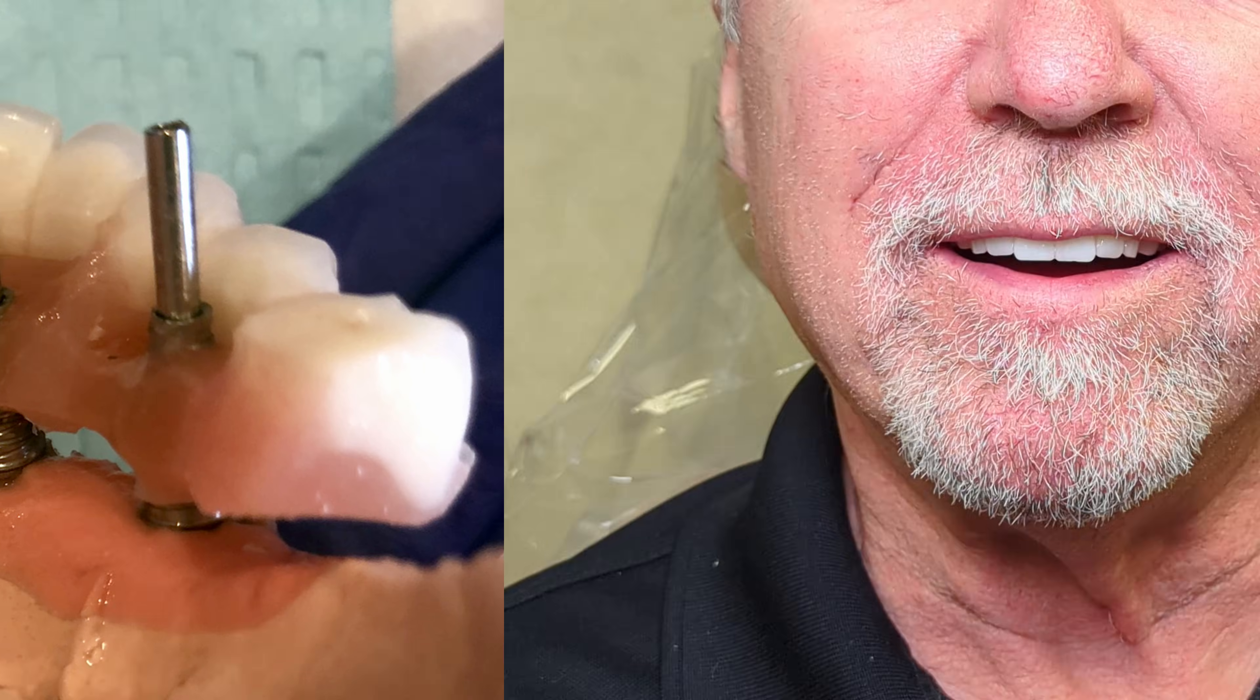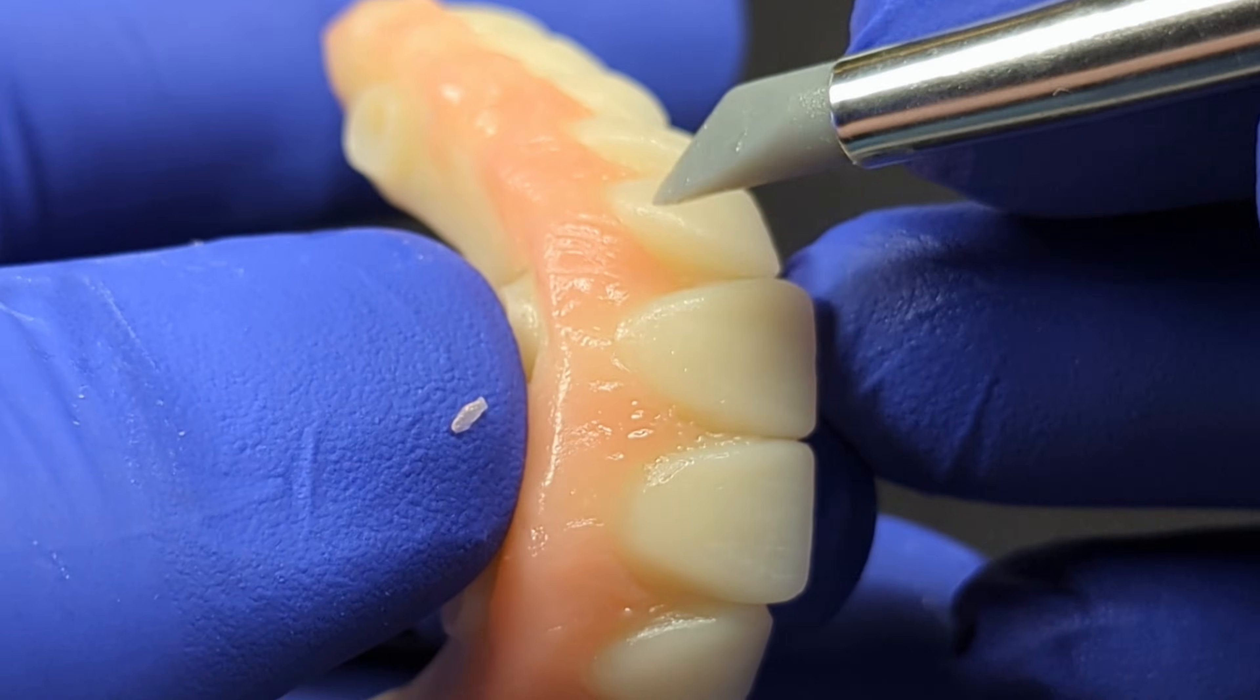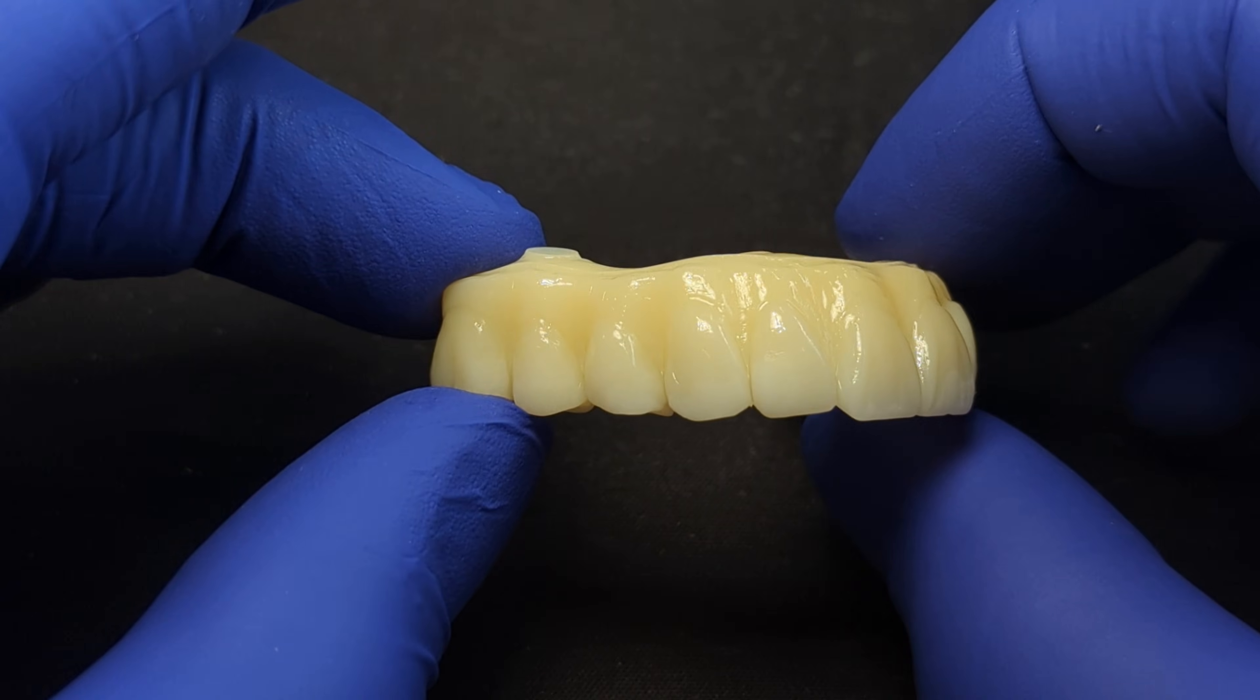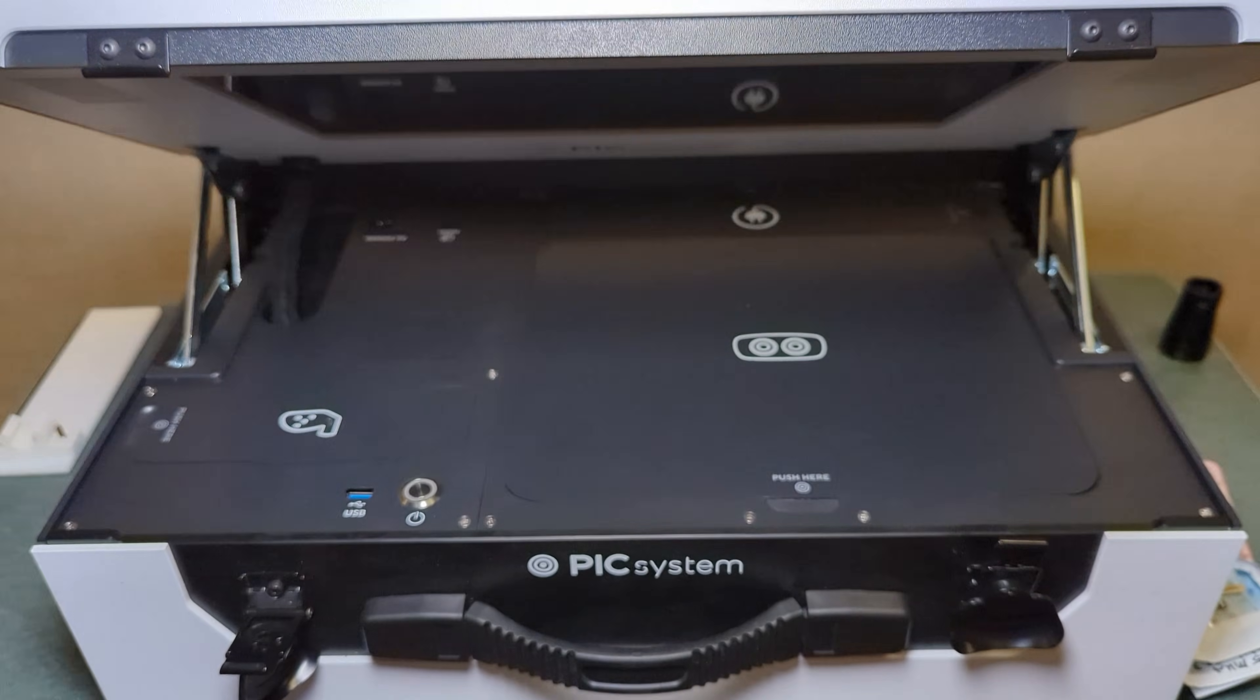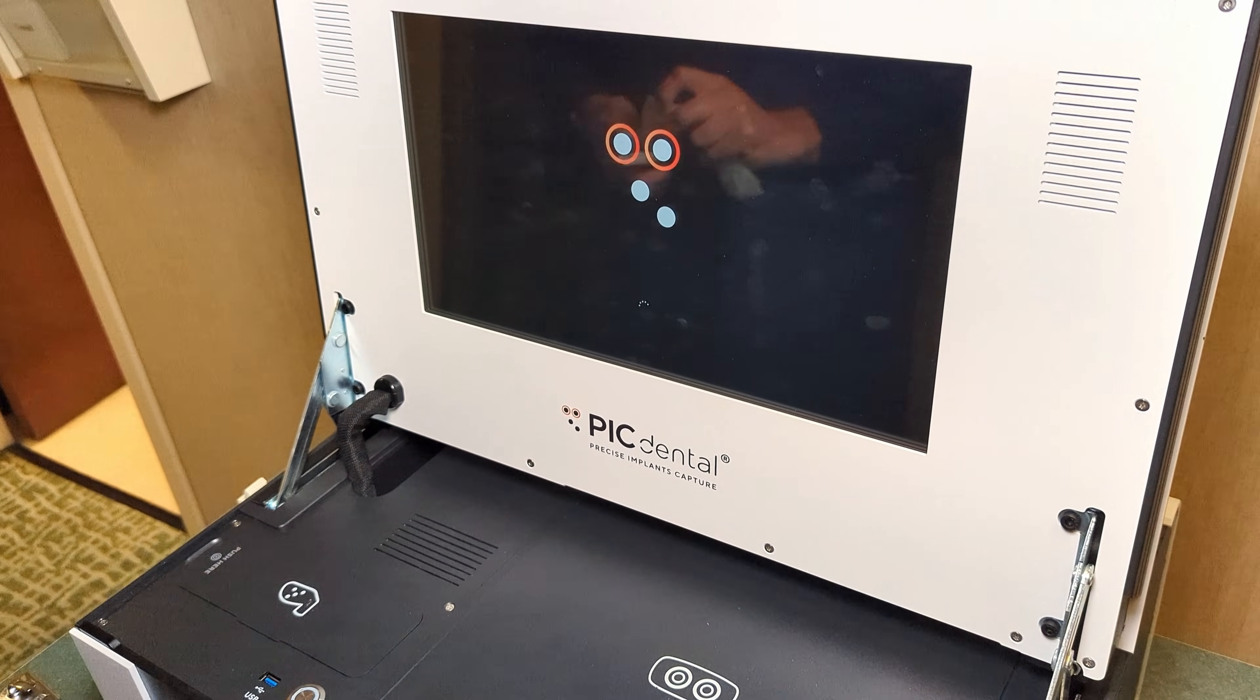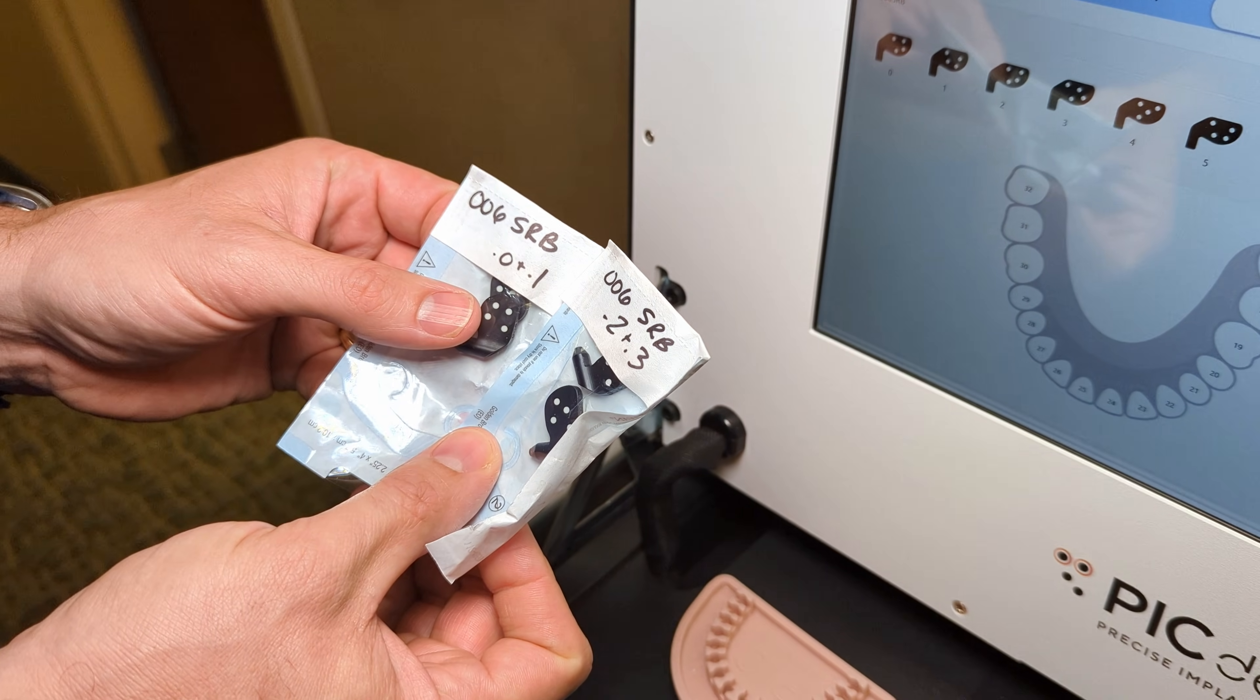Why wait hours or days for analog All-On-X conversions when you can achieve perfect results in just 2 hours? In this video, I will unveil the future dream theme of aesthetic dental prosthesis with a groundbreaking 2-hour All-On-X delivery featuring EasyGum tissue composite strips and cutting-edge photogrammetry technology. Discover how this innovative dual-method approach transforms patient satisfaction and efficiency, delivering beautiful, life-like prosthesis faster than ever.